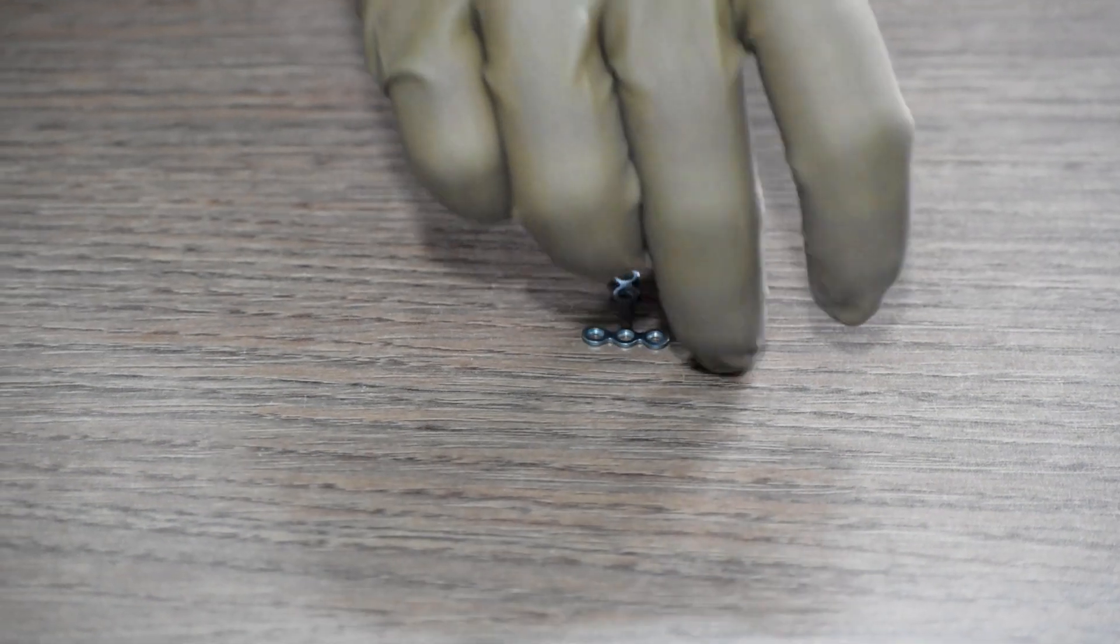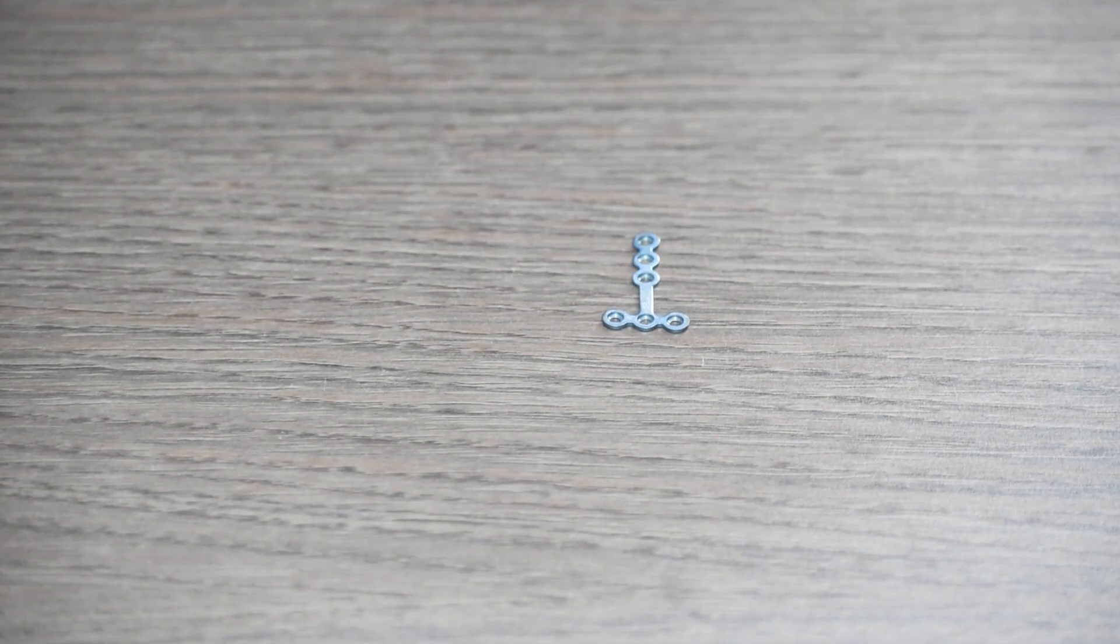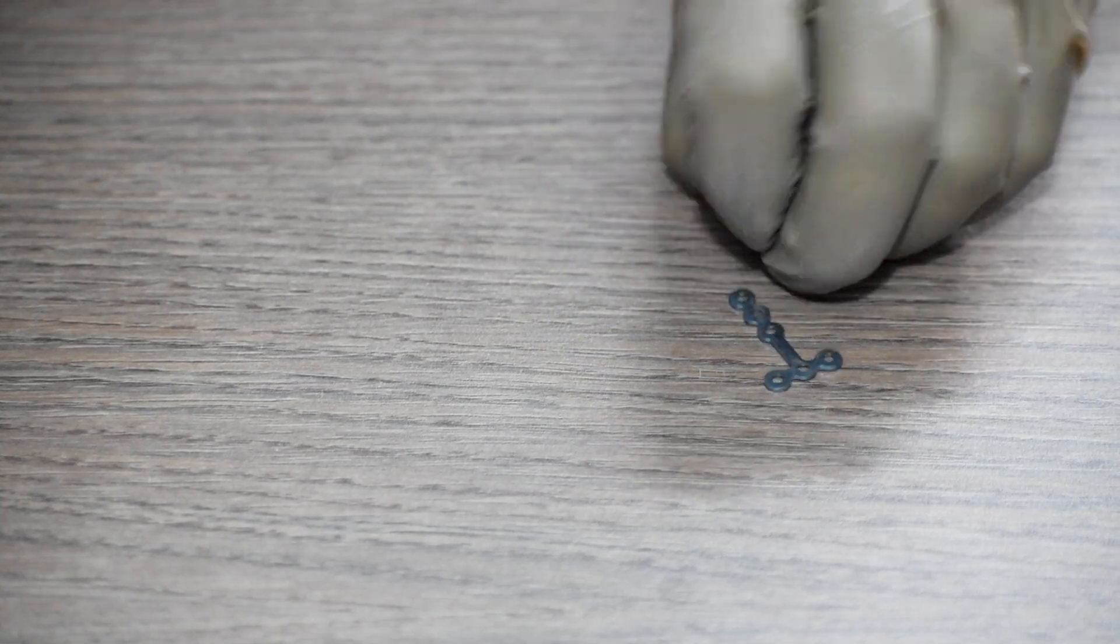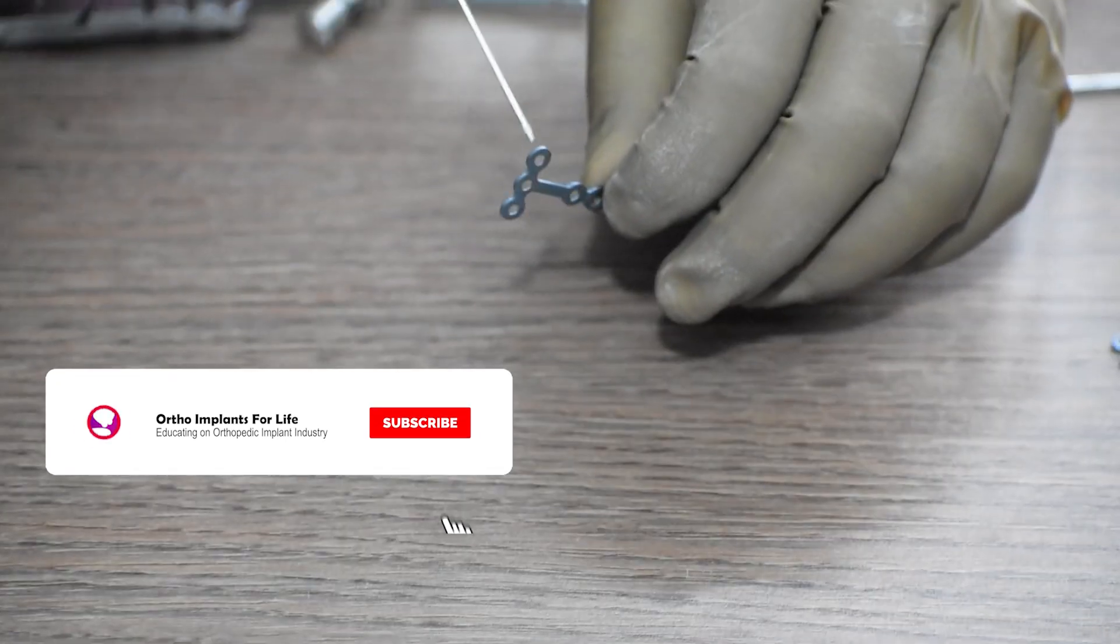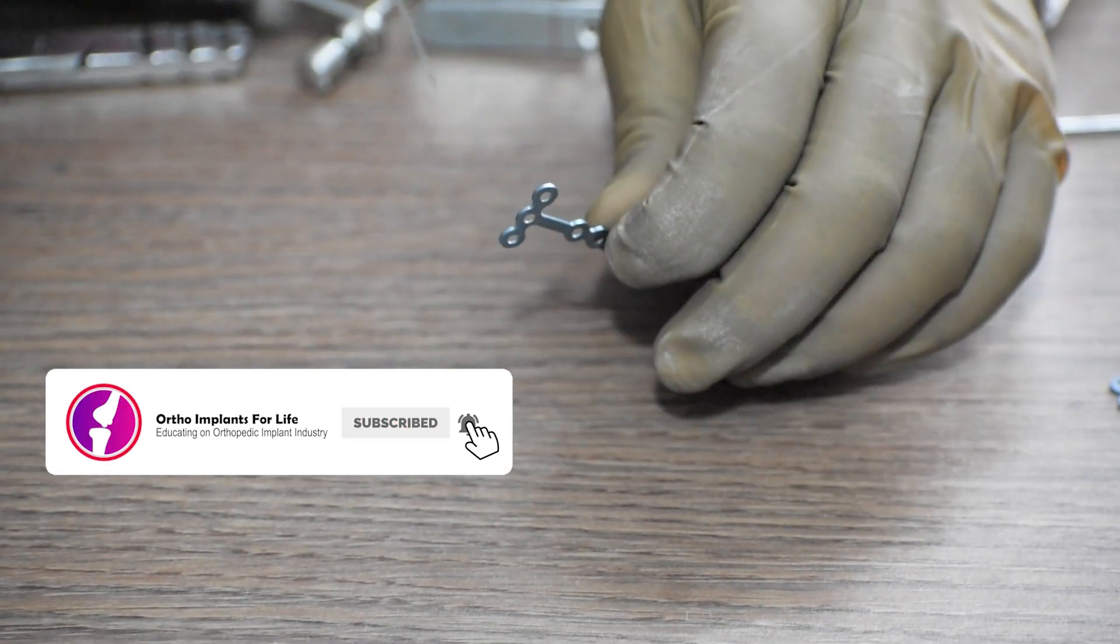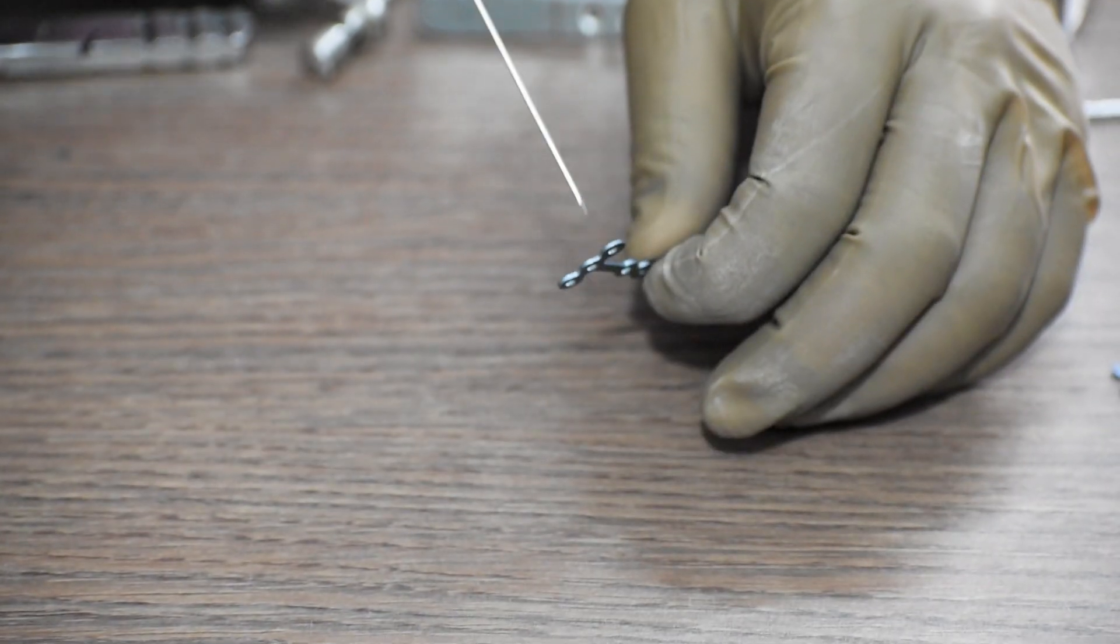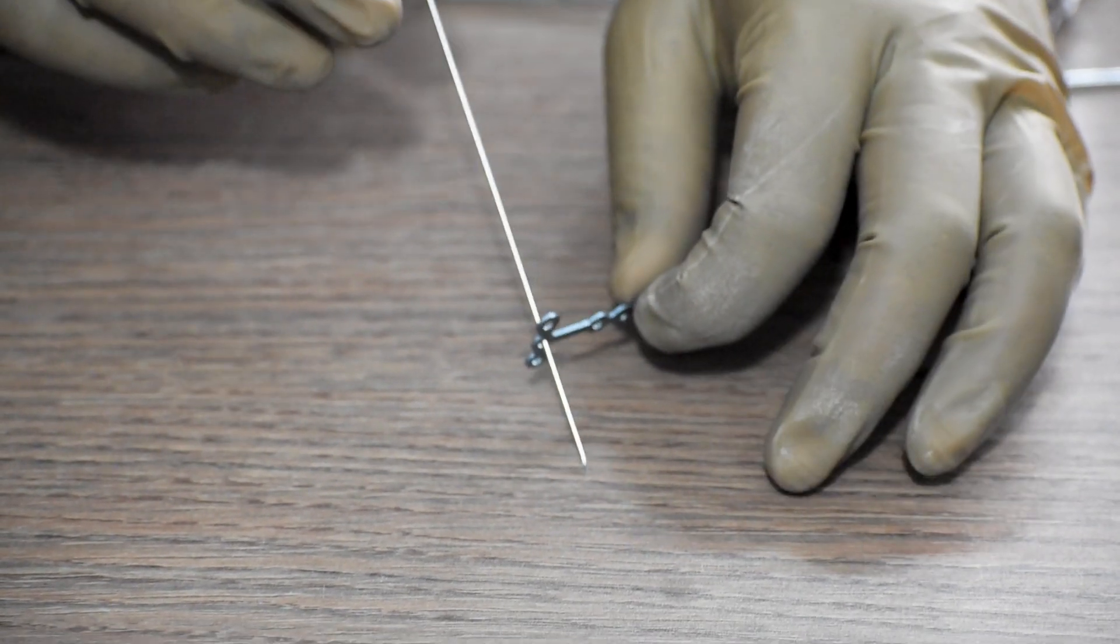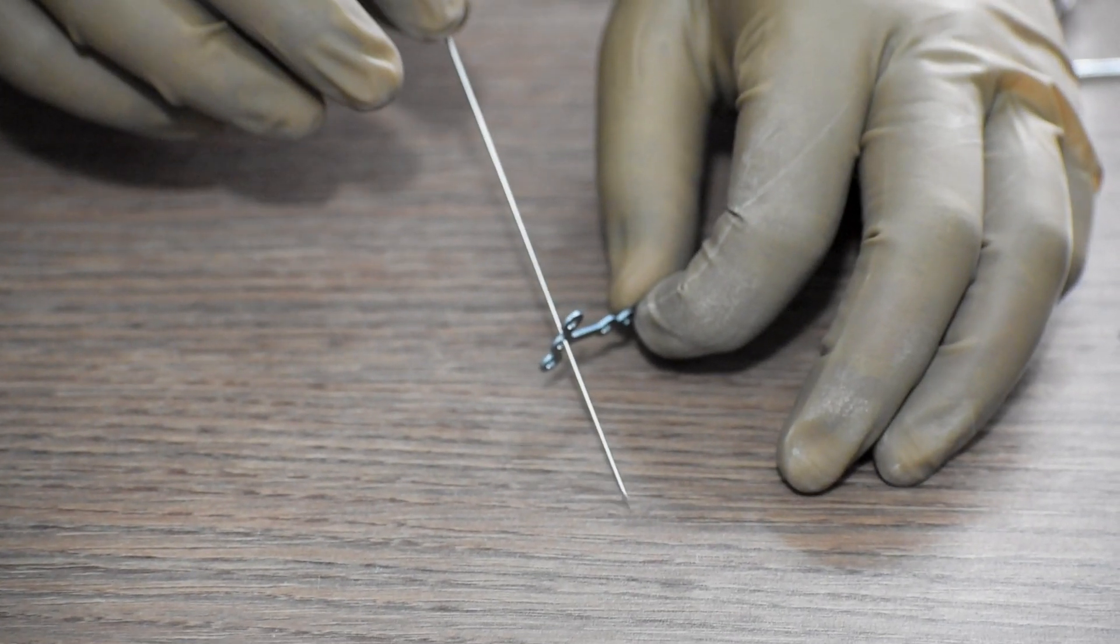We will demonstrate with a three hole head T-plate. First, we will have to hold the plate in the fracture site, for which we can use K-wires like this, by inserting it through this hole and fixing it in the fracture site.